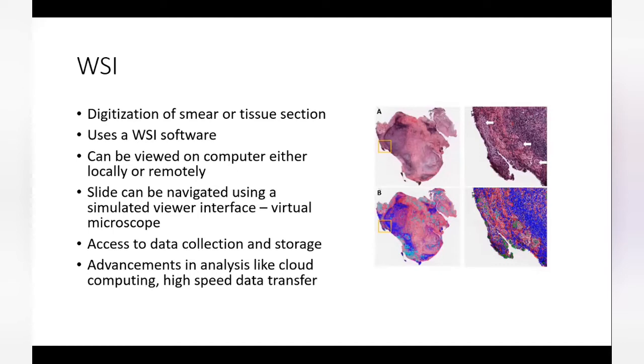So what that typically means is you will be presented with this kind of a slide or an image on your computer screen. You can zoom in or out. You can move your cursor to a relevant area where you think there are suspicious cells. You can magnify them. You can gate them. I mean, or you can just box them in case you're interested and you want to come back. You can save pictures. You can do a lot of analysis with only whole slide imaging.